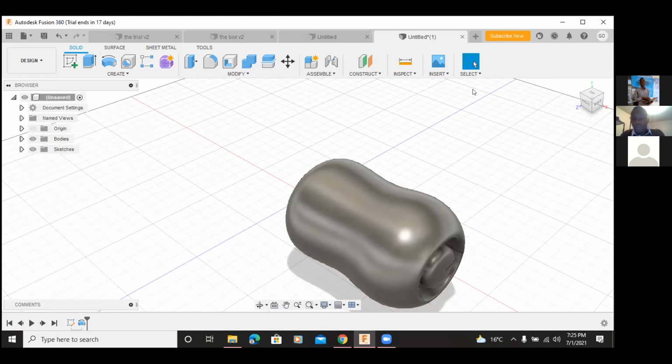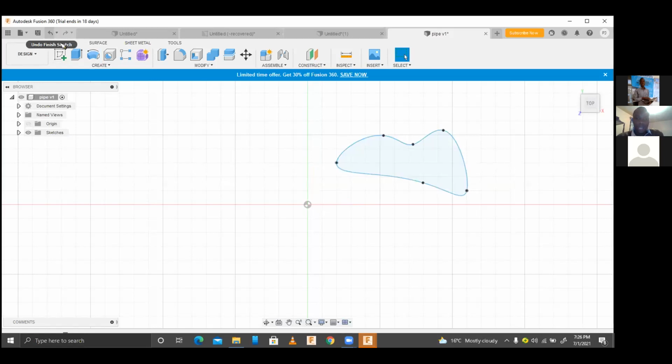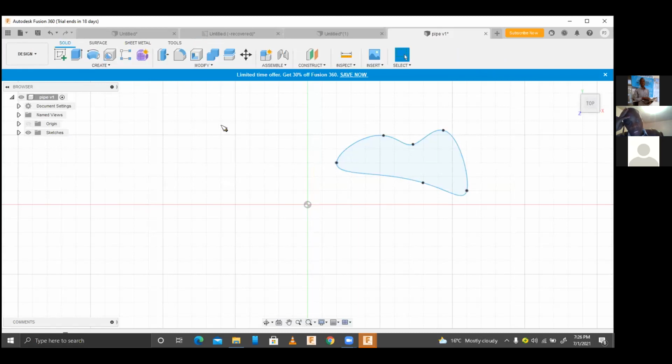Someone else? Thank you. Someone else? Justin, yeah. So Justin, okay. I wanted you, whichever side you are doing it to be more or less straight, but it's okay. Can you finish sketch? We want to see which line you are going to rotate it about. Okay, just create.